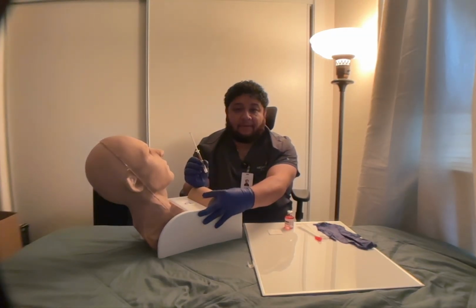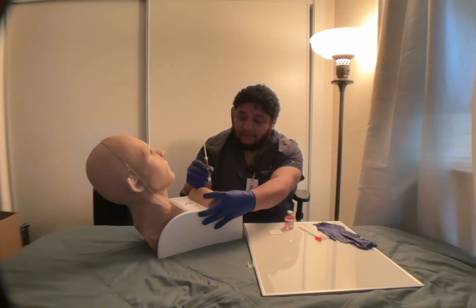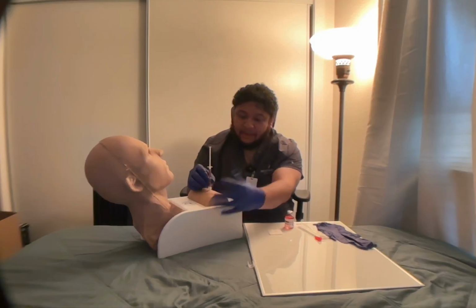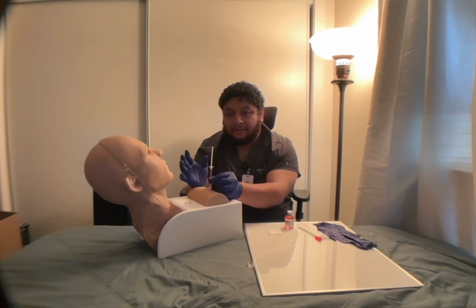And now I'm gonna go ahead and inject the skin. Mr. John, I'm going to give the injection now, okay? Okay, so I'm gonna insert the needle quickly at a 45 degree angle. Now with my non-dominant hand, I'm gonna go ahead and stabilize the syringe, like so.